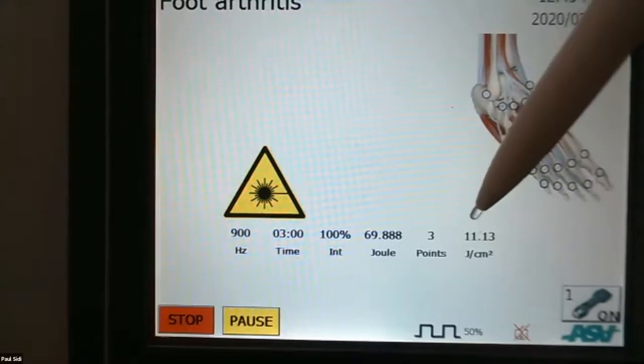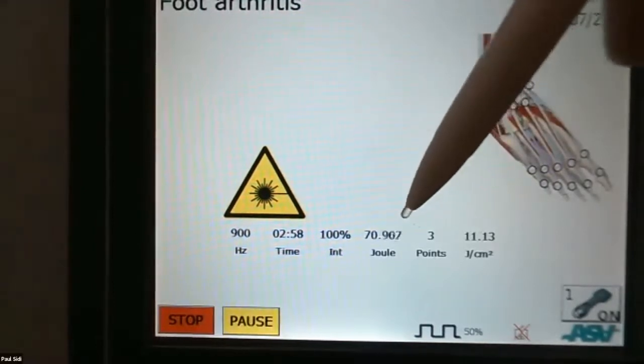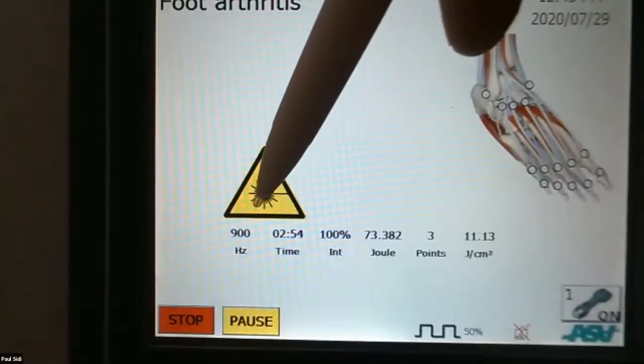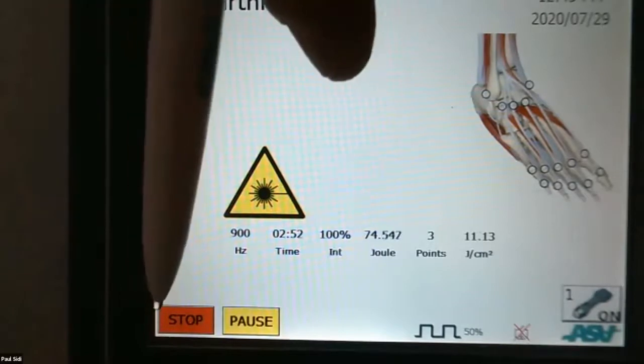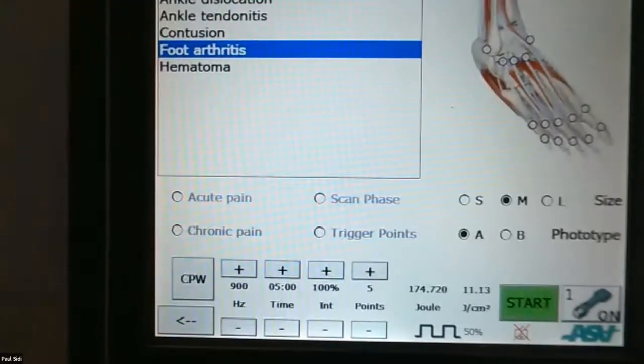It stops itself again, and we just start it going again. So it carries on adding up the joules, starts counting down the time, and it will eventually get to 0, and it will just switch itself off, and it will sound like this. Like that, okay?